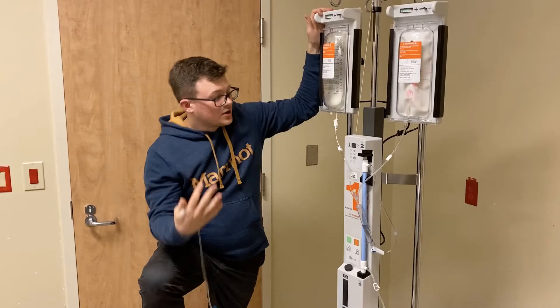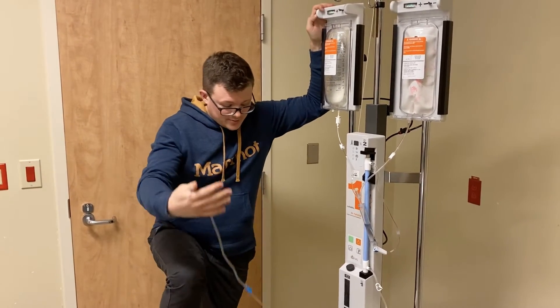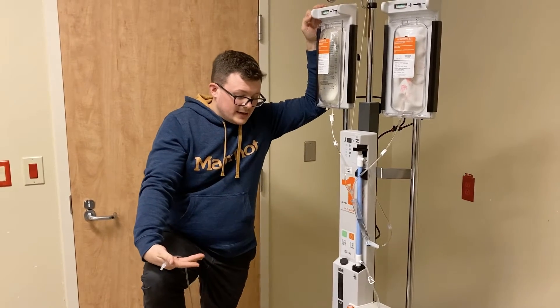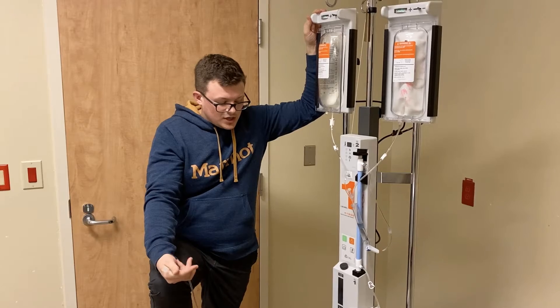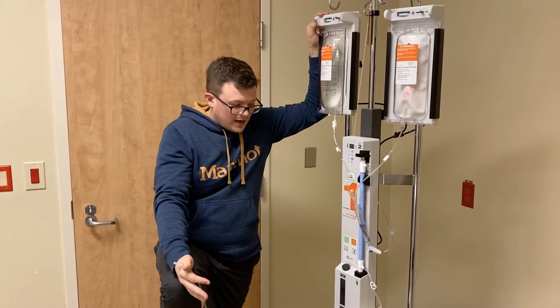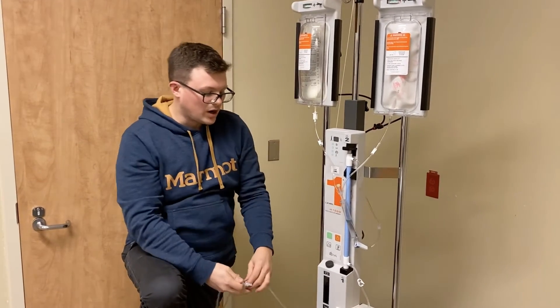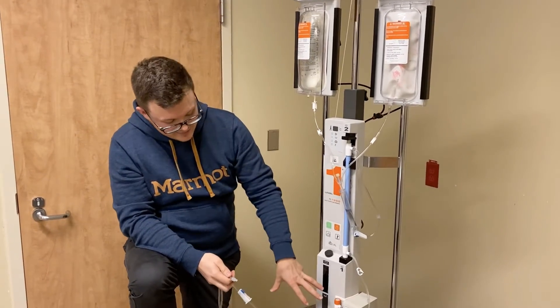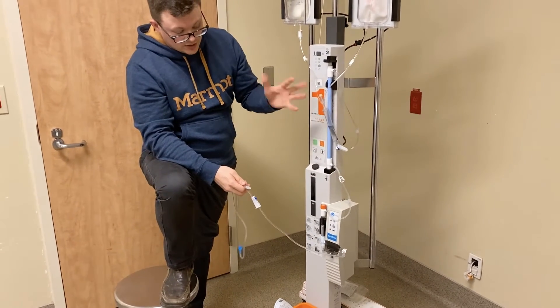Now we're ready to turn on the system. When you do, it's going to beep — that's just the system coming online. If the beeps continue, there might be something you need to change. The most common error is that there's air in the line. All you have to do is open up your roller clamp and continue to prime. Any air that's caught in that chamber you can get out, and the alarm will stop.